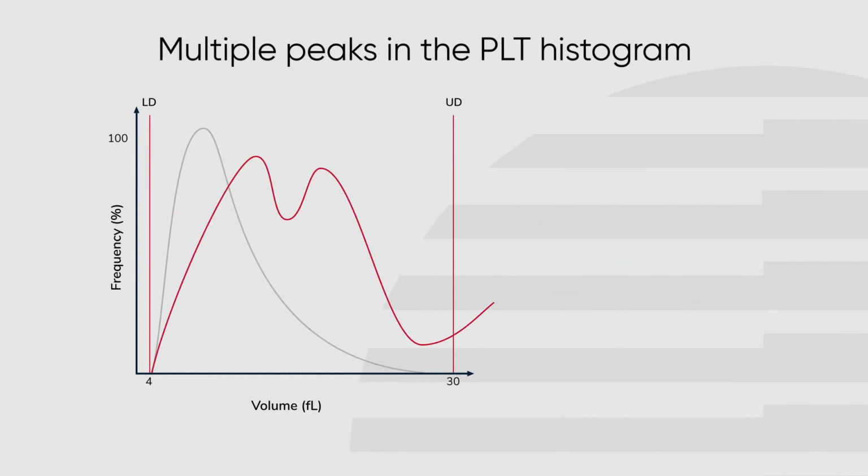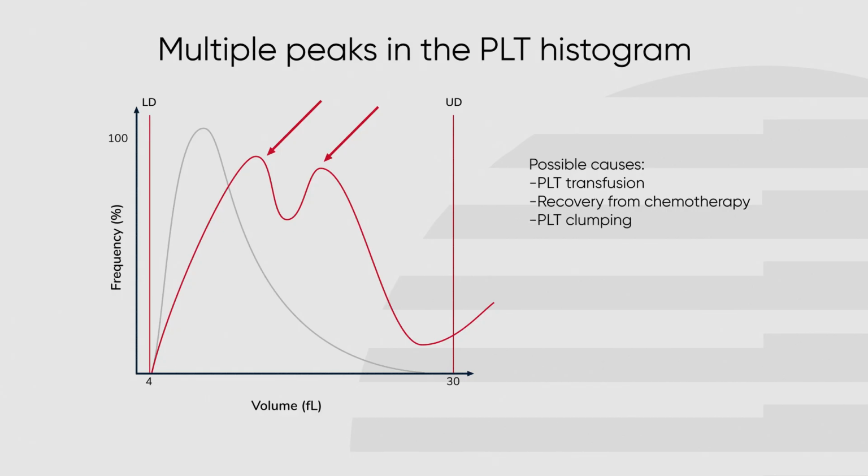If the curve displays multiple peaks, this is an indication that there is more than one population of platelets in the sample. This could have several possible causes such as a recent platelet transfusion, a patient recovering from chemotherapy, or platelet clumping. The reason for the two peaks is extreme anisocytosis, showing varying size in the platelet population. If this occurs, the readings of PDW, PLCR, and MPV may be affected. Proceed to confirm the dimorphic populations in smear.